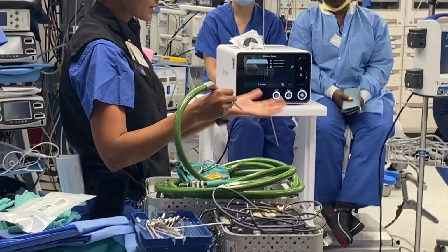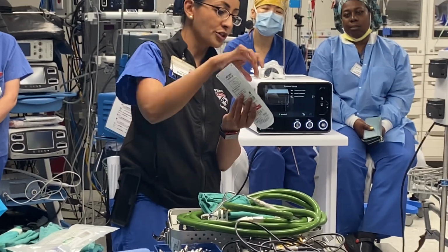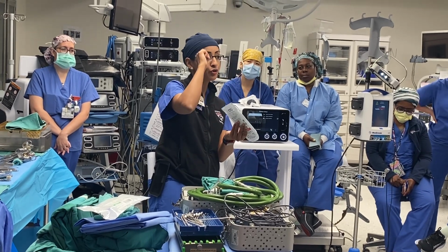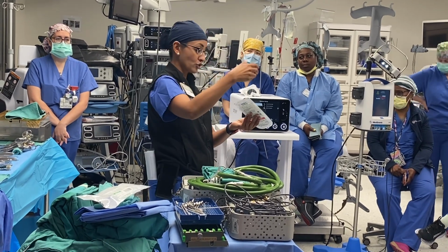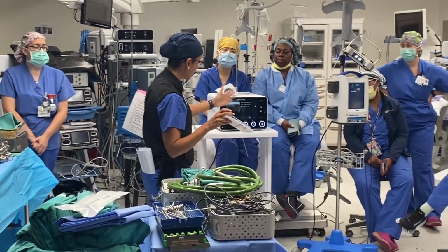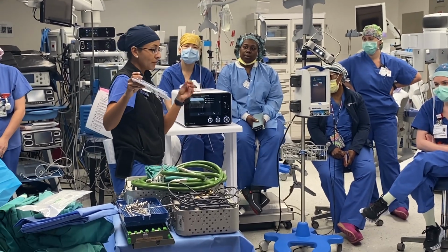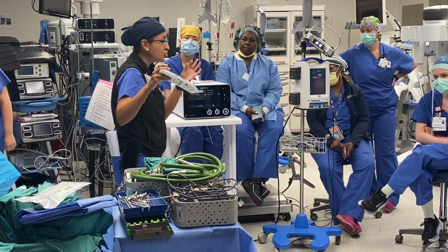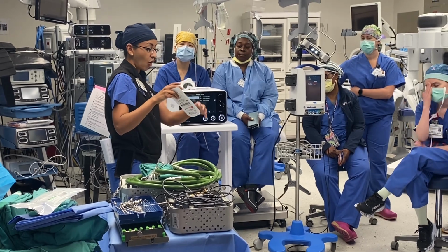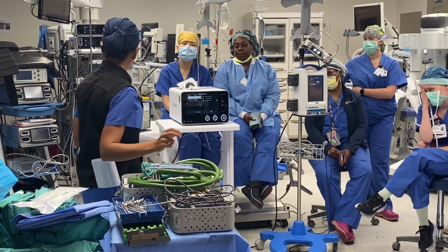both suctioning tissue. It looks like this, okay, and so what we're doing is basically sucking away tissue. In most cases it's tumor, and we are collecting that tumor when we're in critical areas. And it also has the ability to irrigate, which is nice. So all the same kind of reasons, right? Anytime you're messing with the brain, it'll coagulate, tissues will tear. You don't want that in the head, right? So irrigation and suction all in one allows us to carefully take out tumor.